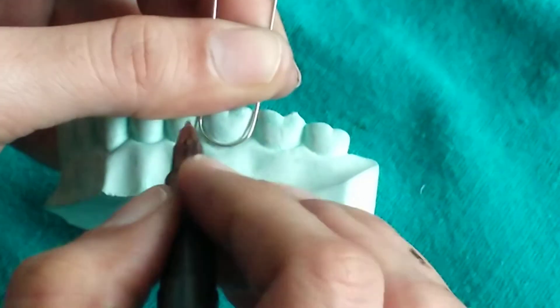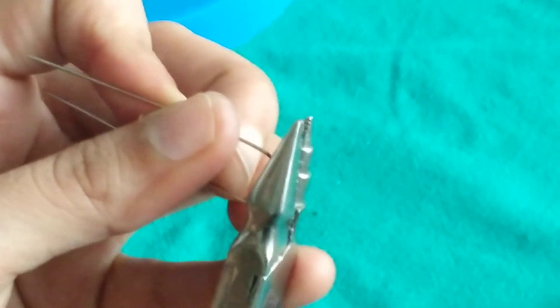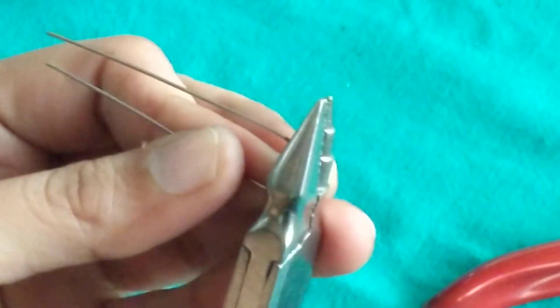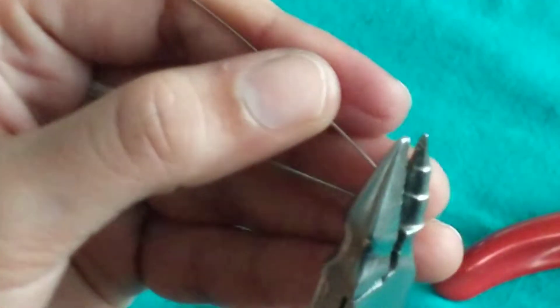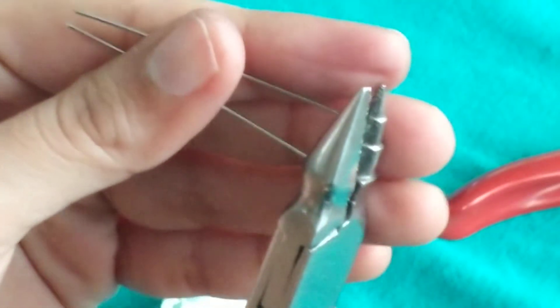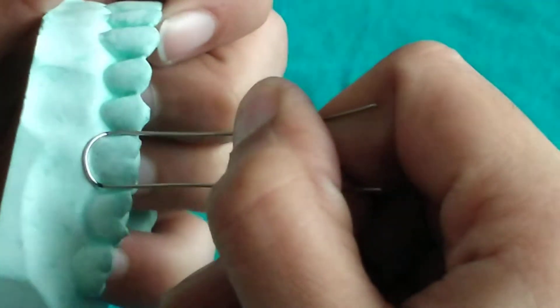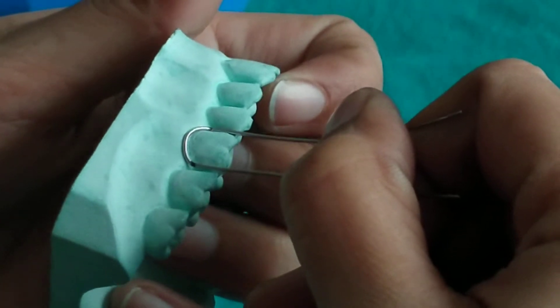Now we will be giving interproximal bends at the mesial and the distal interproximal area. These interproximal retentive bends are given by holding the wire and bending the arms outward at the marked point. We have bent the retentive bends in the mesial and distal interproximal area, as can be visualized from the side view.